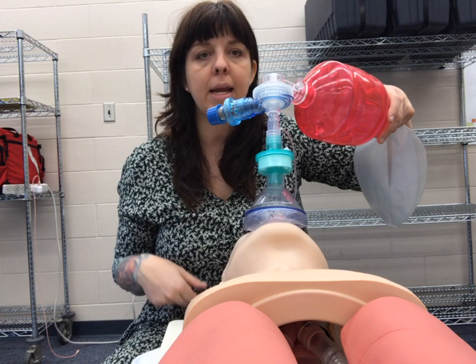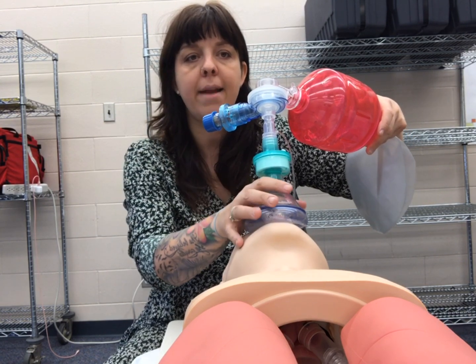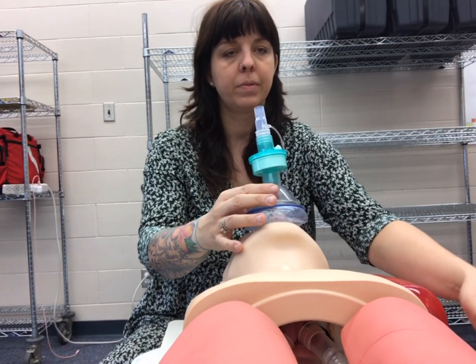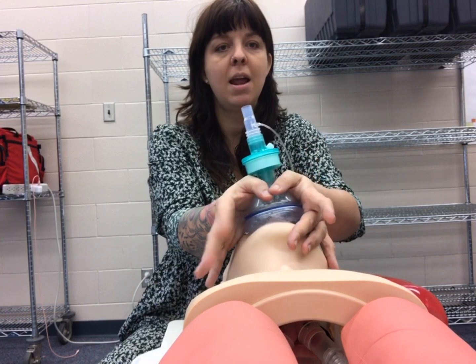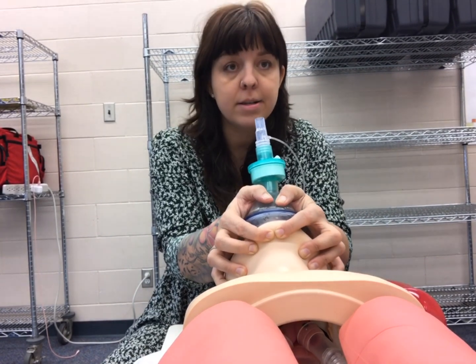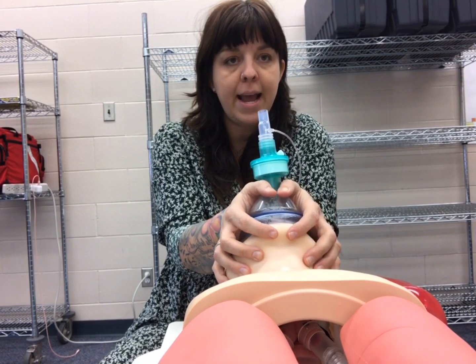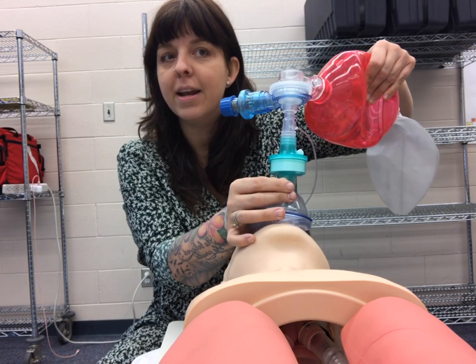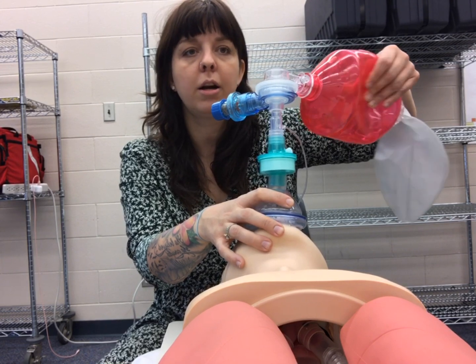I'm going to get a partner and do two-person bagging — this is the most important and most effective thing you can do on a real patient for improving oxygenation. One person bags from the side, one holds the mask at the head. For the seal, rather than a C-and-E grip, marry your thumbs at the end of the mask, spread your fingers like spiders, grab the jaw and lift. This provides the best seal. The person at the head holds the mask, and the partner provides ventilations.